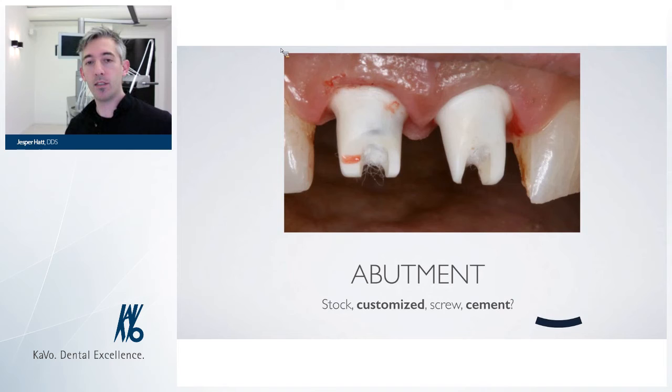And here you see the ability of the technician to place the margin. As you can see, we also used pellets at that point instead of Teflon tape. Today we would definitely use Teflon tape instead, because it's so difficult to get out these pellets, and they tend to get moist and all of that. So here we have the zirconia. We can place the margin perfectly where we want it to.